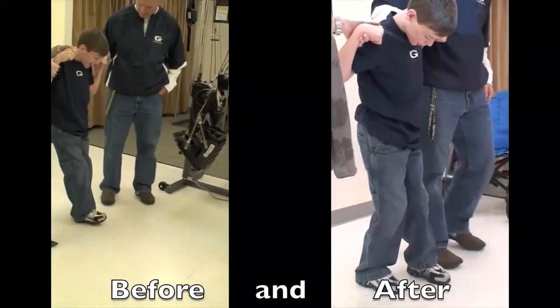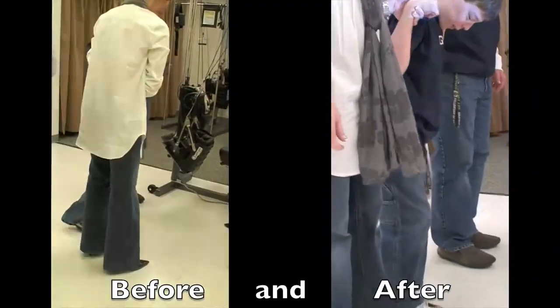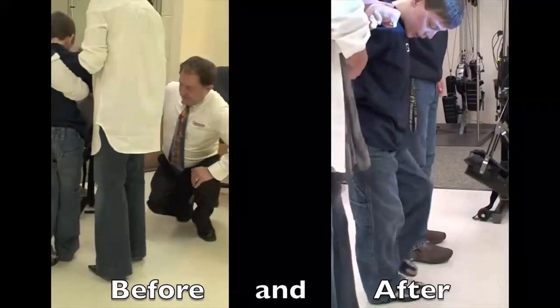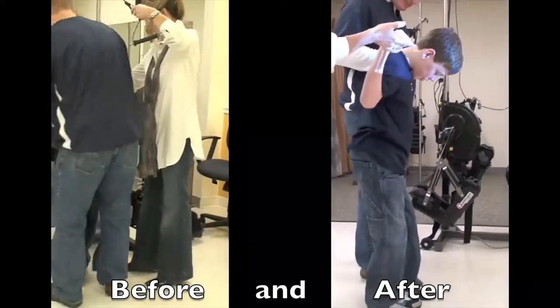Keep your feet apart a little bit. That's better. Look, he's not stepping on his toes now. His toes aren't turned in. Yeah, his toes are not turned in like they were. He's stepping straight — there's no scissors at all. And I was having to hold here to help support, and I'm barely holding. Look at that step. That's much better than I would have thought.